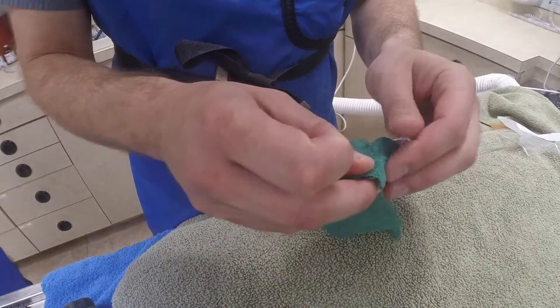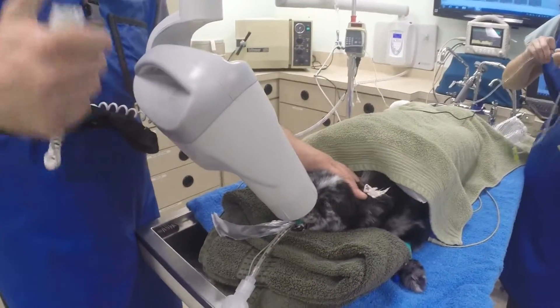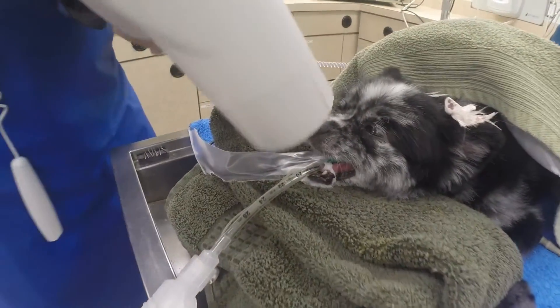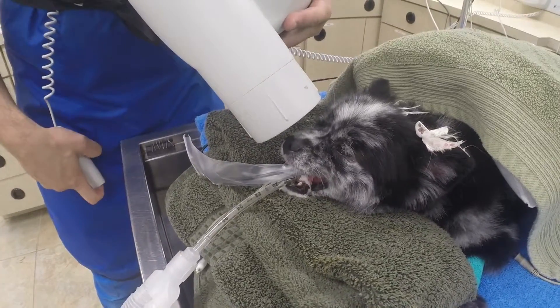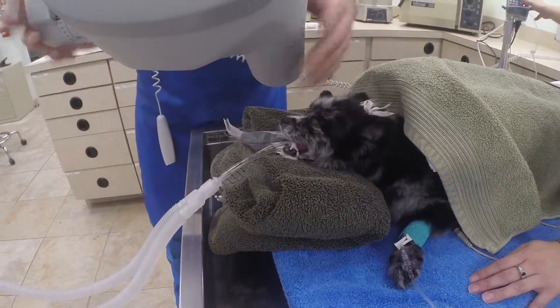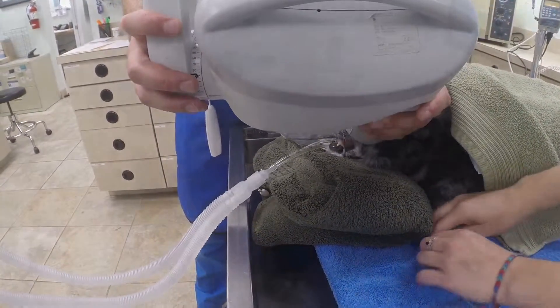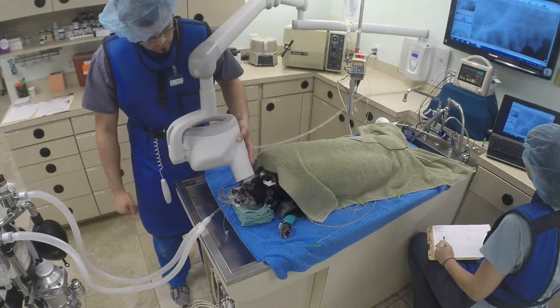A dental plate is prepared for the animal to take x-rays of their teeth. This is a vital step during a dental, since 60% of the tooth is below the gum line. Dental x-rays are required to know what is going on below the gum line past the crown. Although crowns may look healthy, there might be a story below the gum line that we're not aware of without these x-rays. Bone loss and abscesses at the tooth root are some of the things we can identify with x-rays.